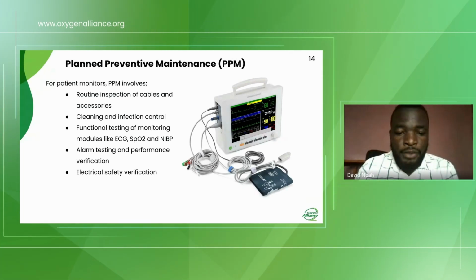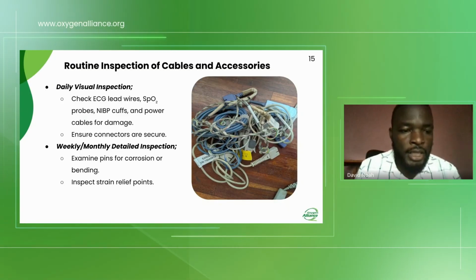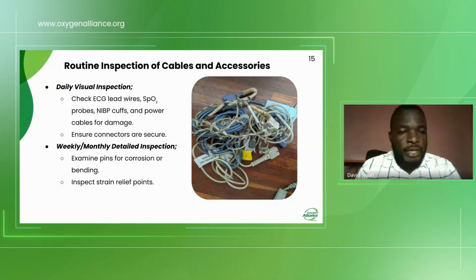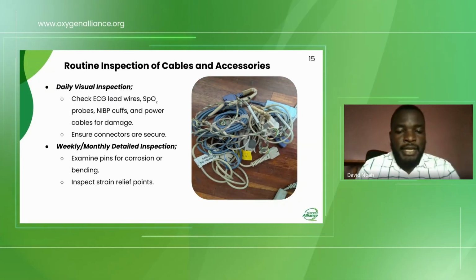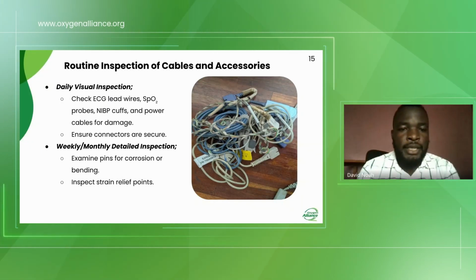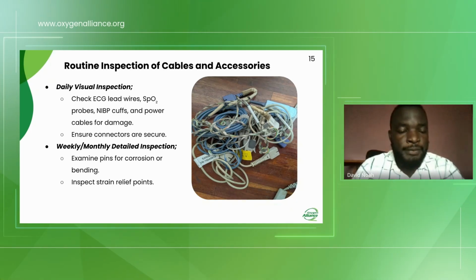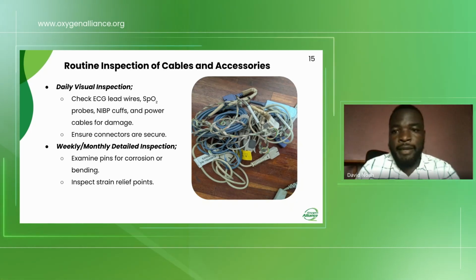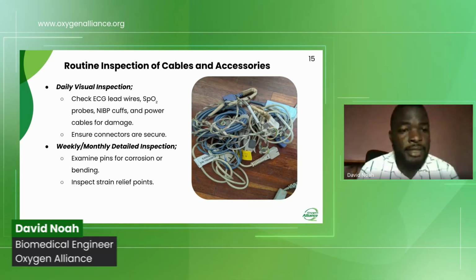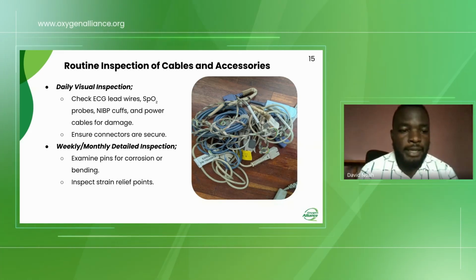To begin with, let us look in a bit of detail at each aspect of the preventive maintenance. The first one is the routine inspection of cables and accessories. This is also an important aspect of the preventive maintenance, because patient monitors rely heavily on accessories, and these accessories are continuously handled in patient care, and hence they are susceptible to damage.